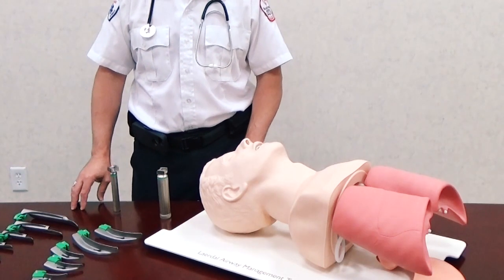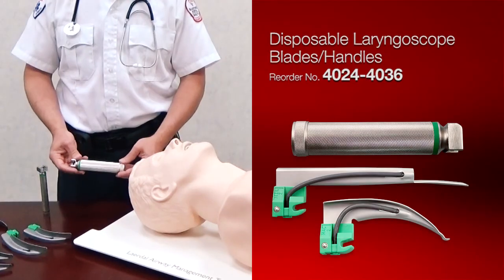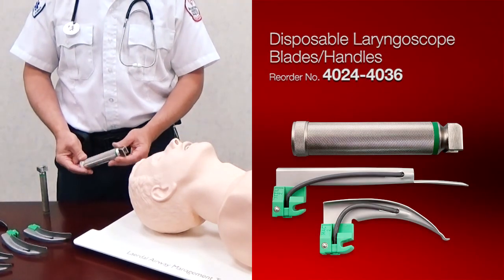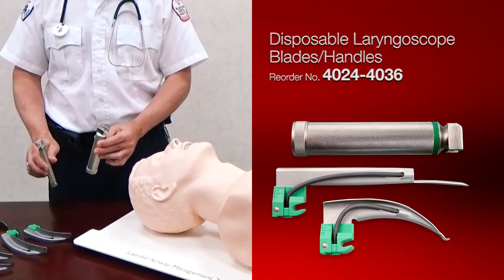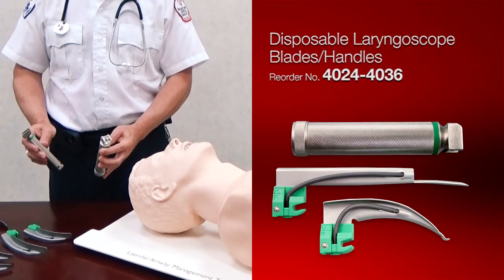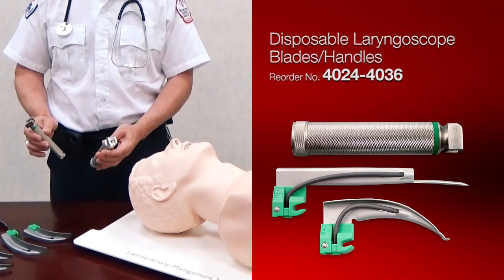We're now going to introduce you to our new line of laryngoscopes. These are going to be disposable in nature. They're going to have two handles — one is adult size or standard, and the other is a mini Penlite pediatric size.